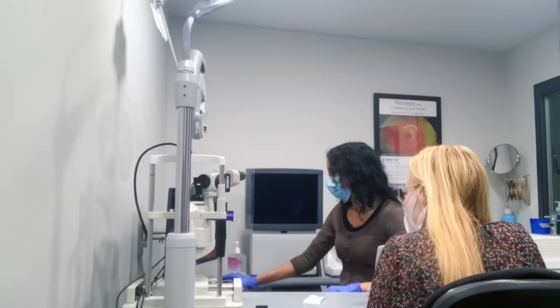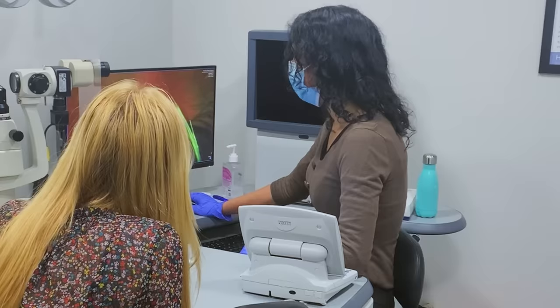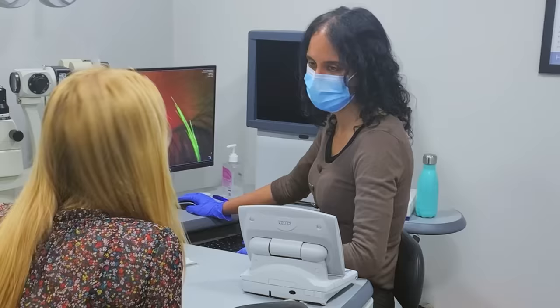Good, excellent. Very good. And the eye is the only part of the body where one can look at a person's blood vessels directly. So yours look perfectly healthy. Sometimes certain general health conditions can show up, like diabetes and high blood pressure. But yours look like they're in very good condition.